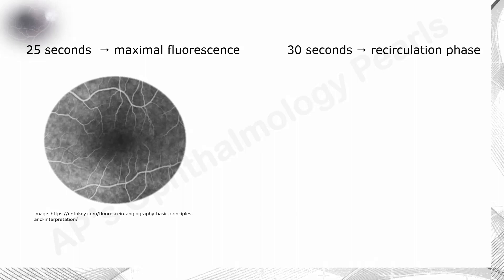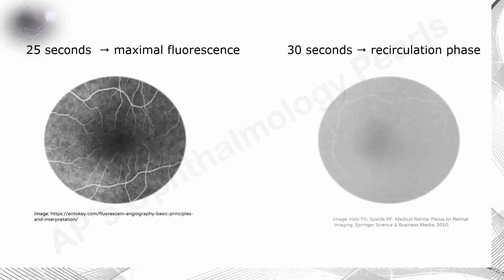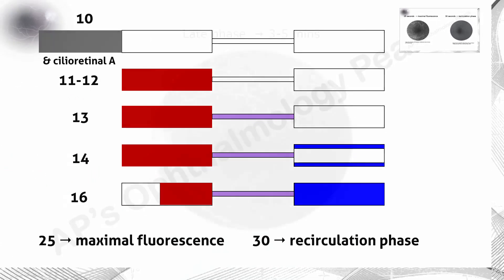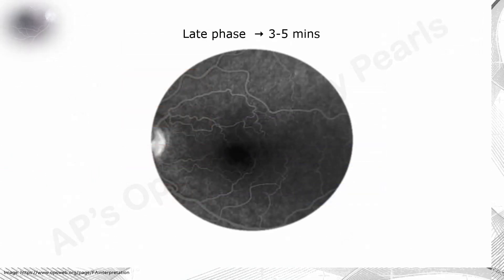Approximately 30 seconds after injection, the first high-concentration flush of fluorescence begins to empty from the choroidal and retinal circulations, and in the recirculation phase, fluorescence at a lower concentration continues to circulate in the fundus. The late phase, typically three to five minutes following injection, demonstrates the gradual elimination of dye from the retinal and choroidal vasculature.